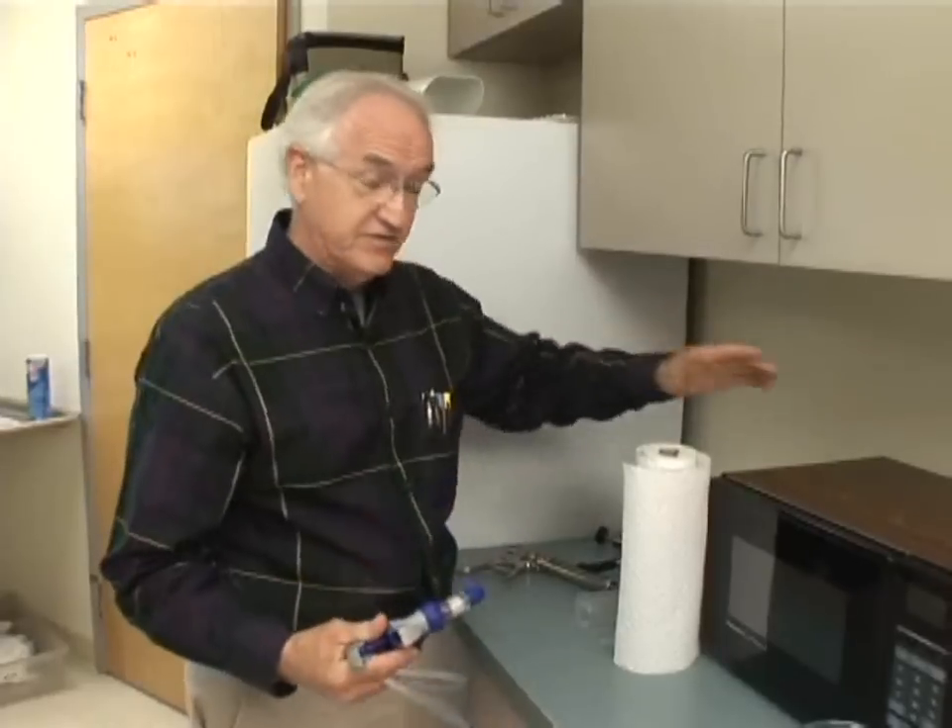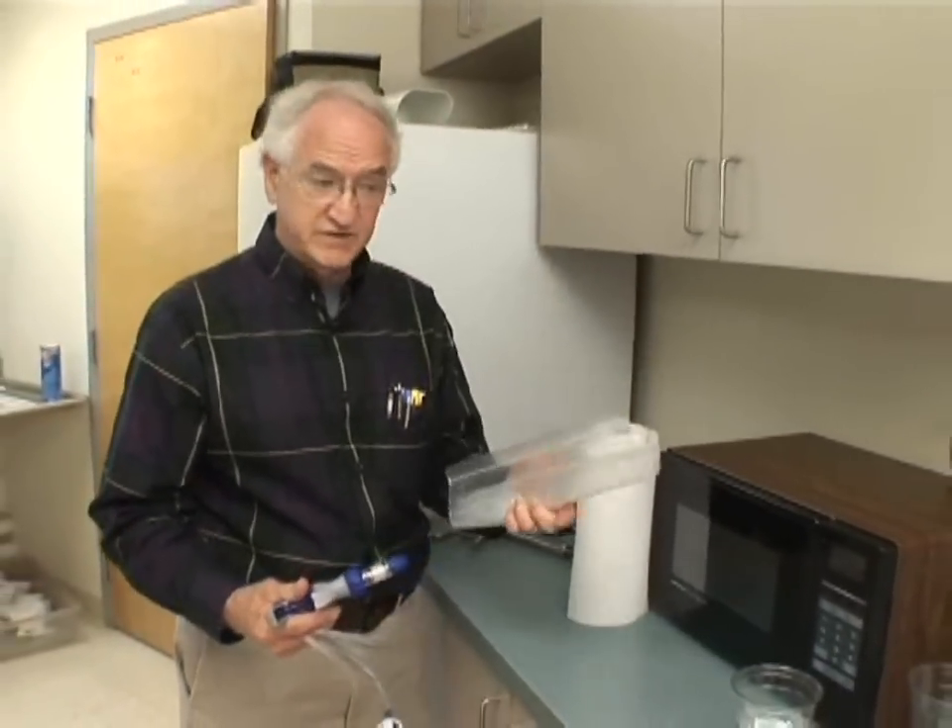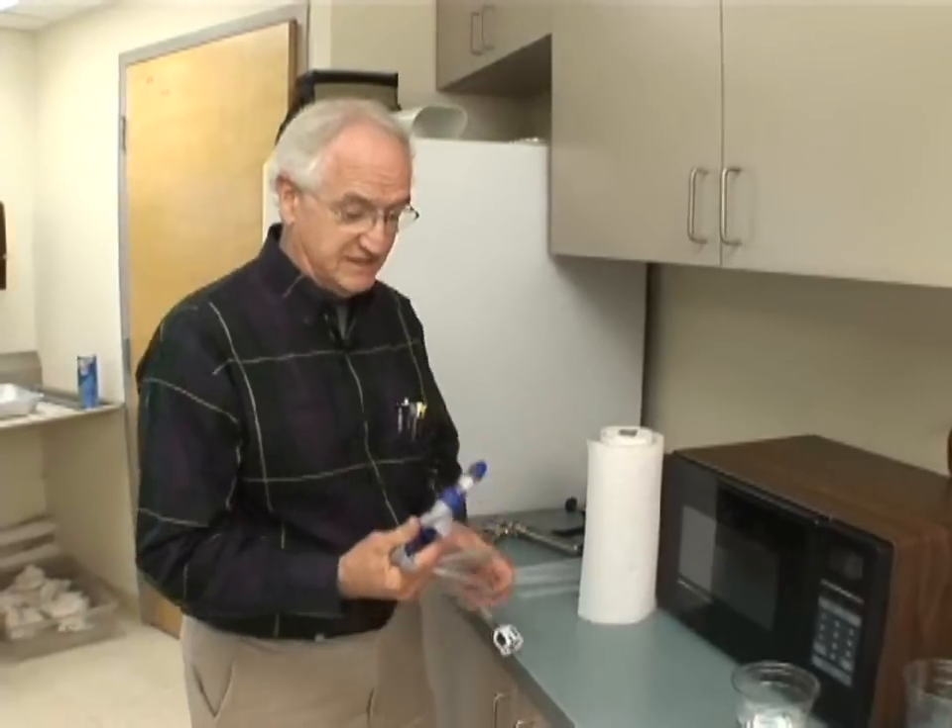The other things I need for this is a microwave oven, some paper towels, and some sort of a ziplock plastic bag.